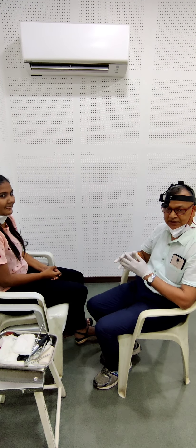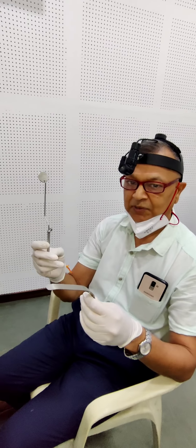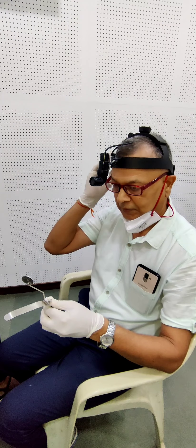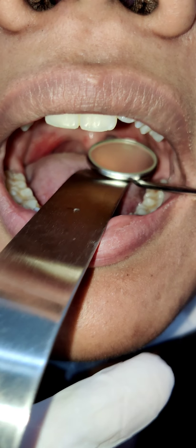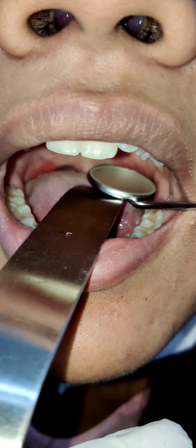The method of performing posterior rhinoscopy examination: for this, we will need a tongue depressor held in the left hand, and then we will need the posterior rhinoscopy mirror. Now I will show the proper method. In the left hand, we should hold the tongue depressor and press the tongue. Then we will introduce the posterior rhinoscopy mirror — it should not touch the posterior pharyngeal wall. We should try to see the structures of the nasopharynx: the lateral wall, the opening of the Eustachian tube, the fossa of Rosenmüller, and the posterior pharyngeal wall. Ideally, we can see the posterior ends of the nasal cavity through the posterior choanae — the posterior ends of the turbinates: middle, inferior, superior turbinates, and the posterior ends of the meatuses: superior, middle, and inferior meatuses.